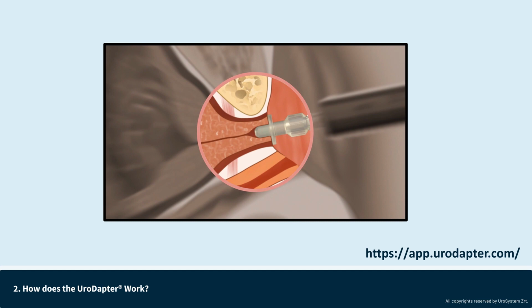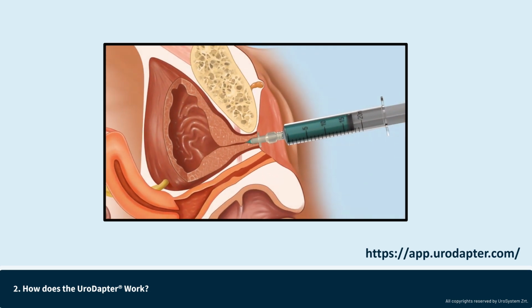If you feel that the patient is tense or anxious and cannot relax her sphincter during instillation, just slow down or pause the instillation. Instruct the patient to take a few deep breaths and relax her pelvic muscles and sphincter. Resume only when the patient has relaxed her sphincter. Remember, during proper instillation, the instilled solution will flow through the urethra easily without any major resistance.